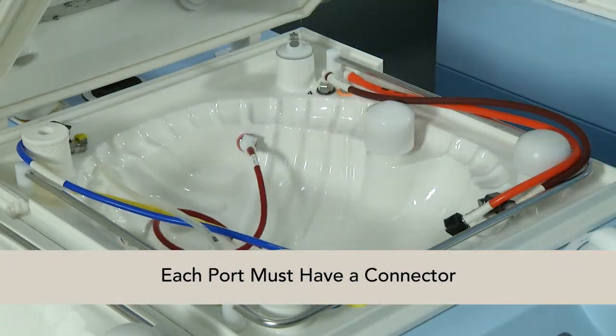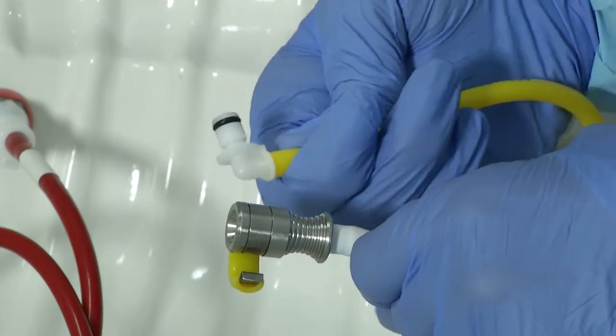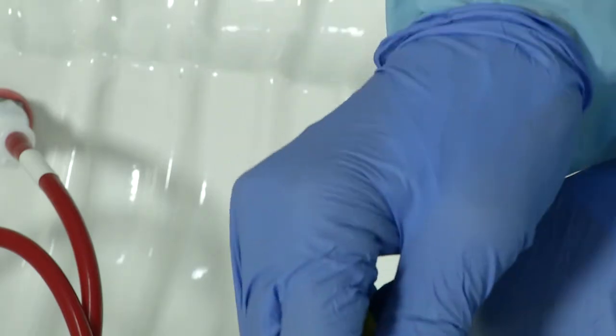You must have a connector in each port to ensure that each scope channel will receive proper perfusion of chemicals, air, and water. While placing the connectors, inspect them for wear and tear, and replace them if you notice any tears, cracks, or damage.